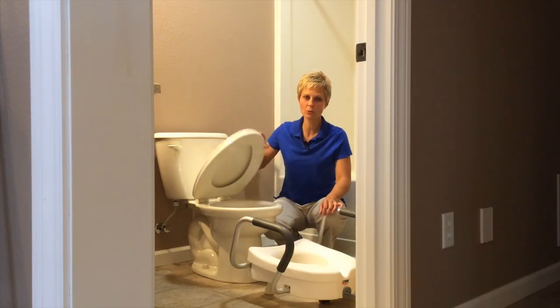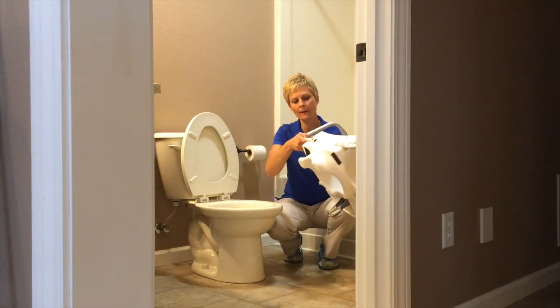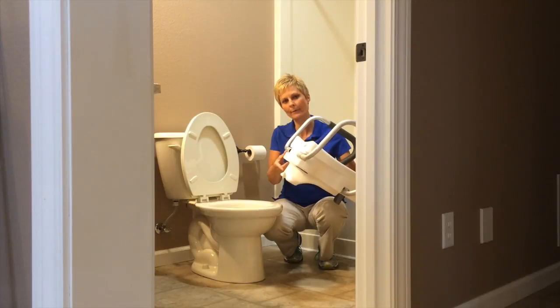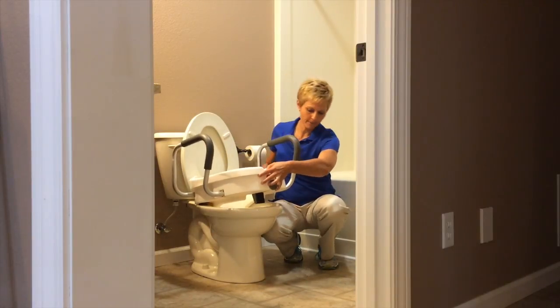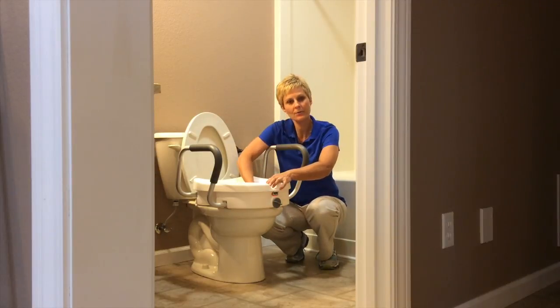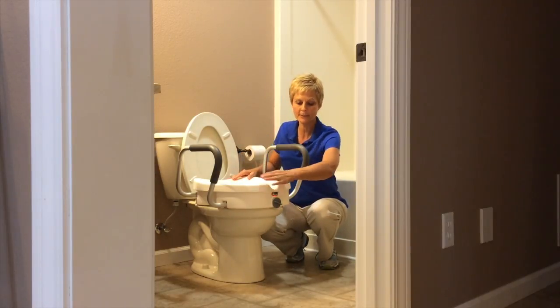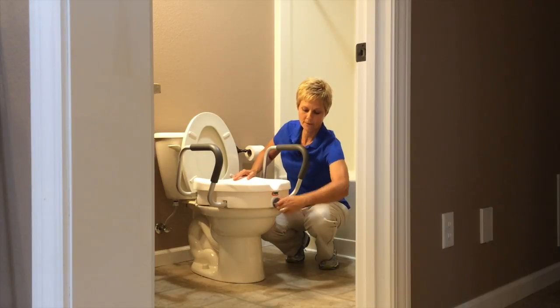What we're going to do is raise the toilet lid and the toilet seat. And if you'll see here, these little lips on the back of this, you're going to put up underneath the back rim of the toilet. And then the little clamp on the front of this toilet seat, you're going to tighten by rotating this in the front.